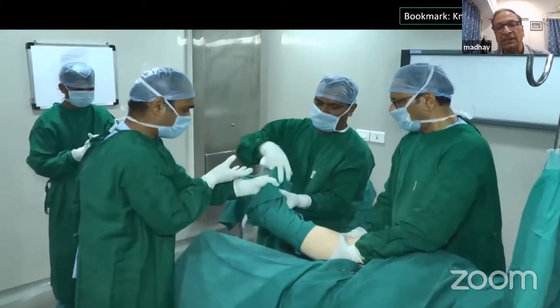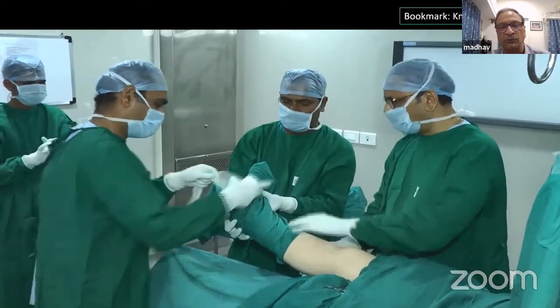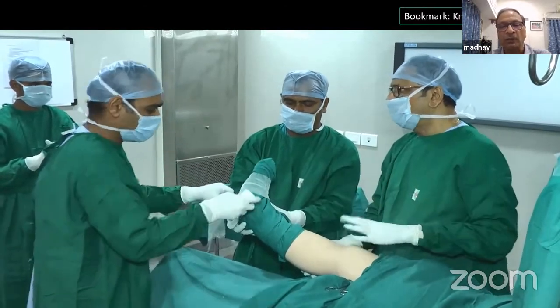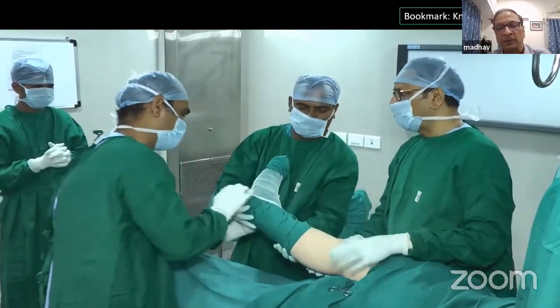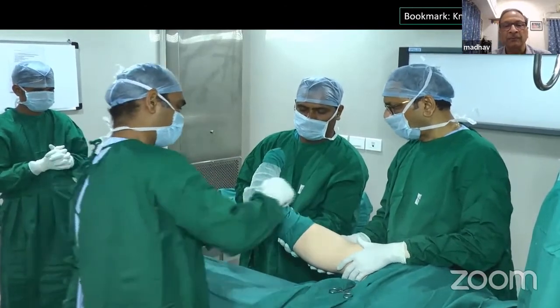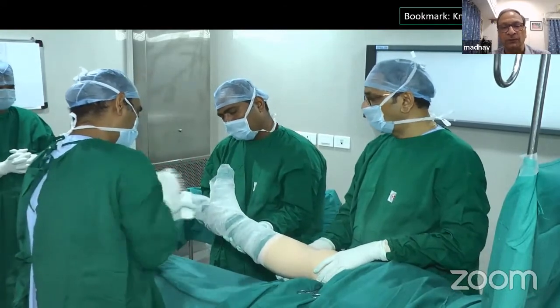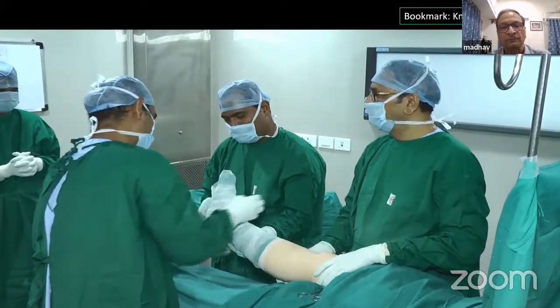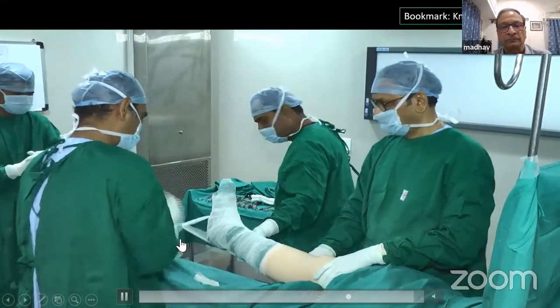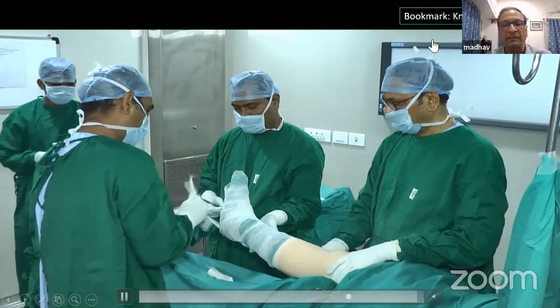So here you can see the knee and the upper third of the leg. So this type of draping would be useful in any surgery on the knee or on the upper end of the tibia, where you don't really need to keep the ankle, foot, and the lower third of the leg exposed. So you secure it with a bandage.